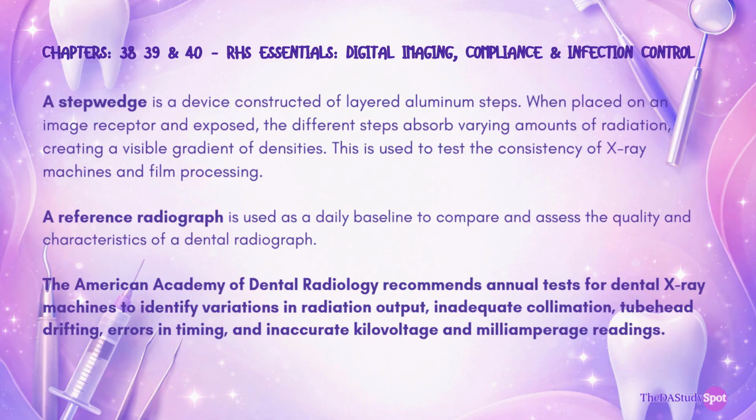A reference radiograph is used as a daily baseline to compare and assess the quality and characteristics of a dental radiograph. The American Academy of Dental Radiology recommends annual tests for dental X-ray machines to identify variations in radiation output, inadequate collimation, tube head drifting, error in timing, and inaccurate kilovoltage and milliamperage readings.